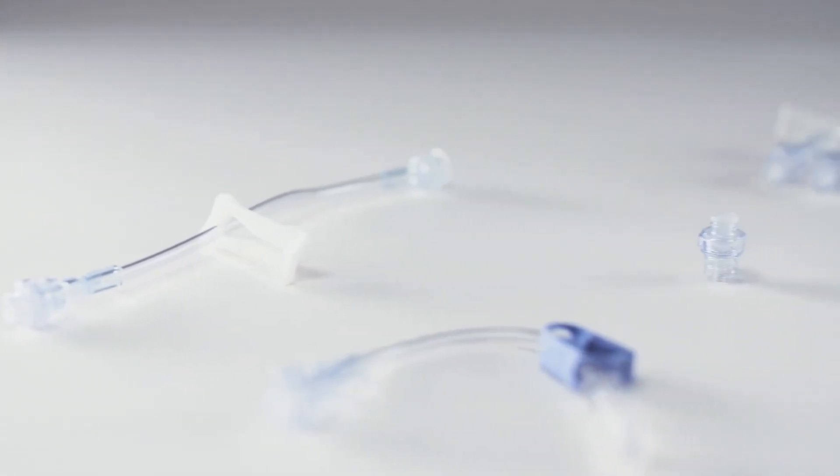The BD Q-Site needle-free connector is available in many different extension set configurations to allow you to optimize medication delivery for all your patients.